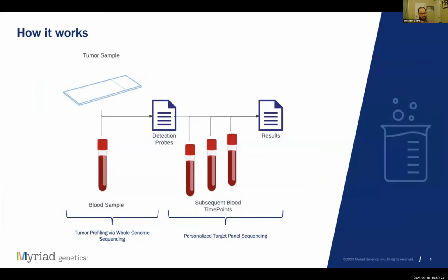MRD is a complex assay, but in summary, a tumor sample and the buffy coat are isolated from whole blood and sequenced on the NovaSeq X. This sequencing is used to call somatic variants present in the tumor genome but not present in the germline genome, coming up with detection probes. These variants create the detection probes for targeted sequencing of the patient's plasma at baseline and subsequent time points. These are also sequenced on the NovaSeq X. So this starts with the baseline and adds these additional time points, leading to the patient results.